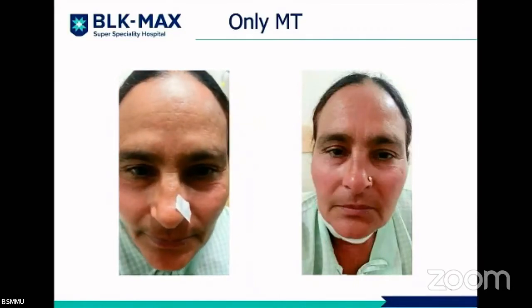This is after thyroid surgery. The patient had unilateral vocal cord palsy, and we did type 1 thyroplasty.